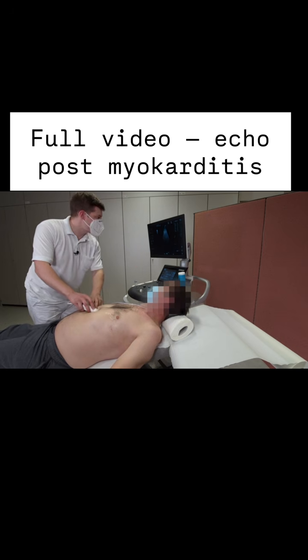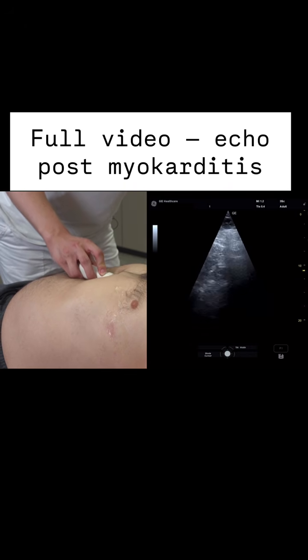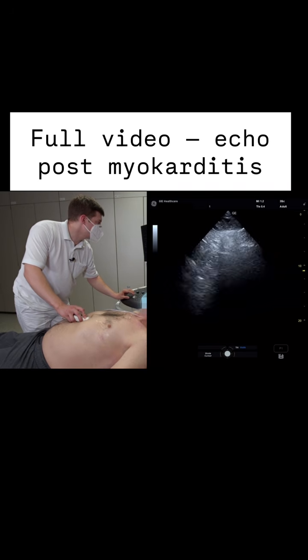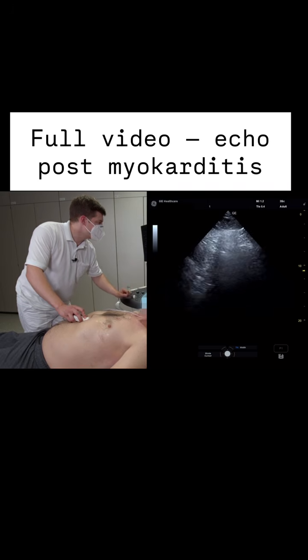What we are going to do now is we scan the heart from a subcostal view. We need a little bit more depth, and I don't like the width. I want it a bit wider, not too wide, so we don't lose the frame rate. And now we have to ask the patient to inhale.